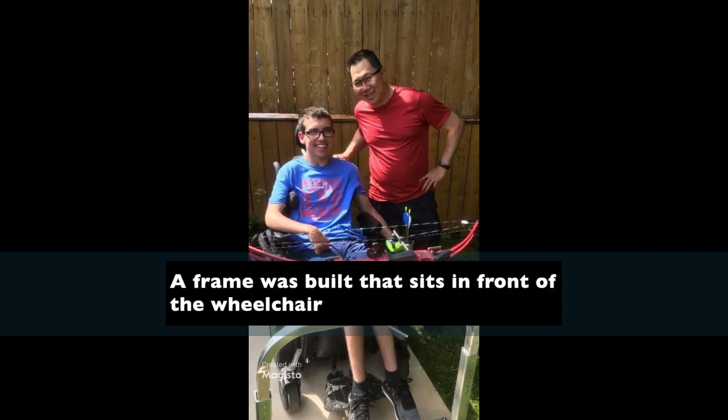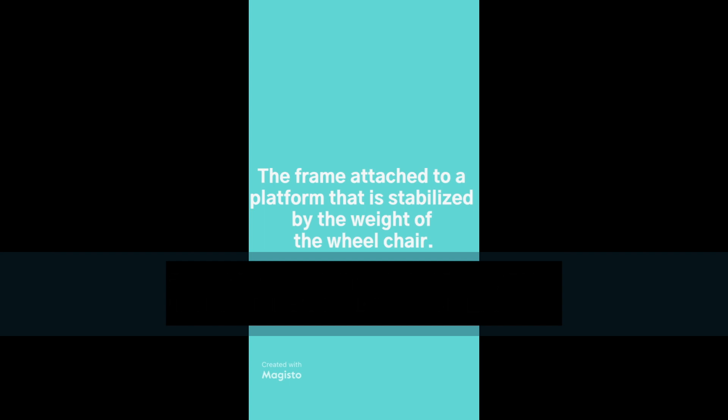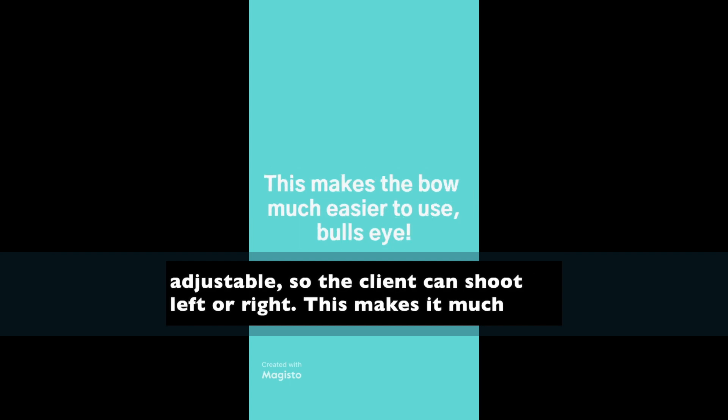A frame was built that sits in front of the wheelchair, and on top of the frame is an additional platform. This platform can go up and down and it's adjustable, so the client can shoot left or right.